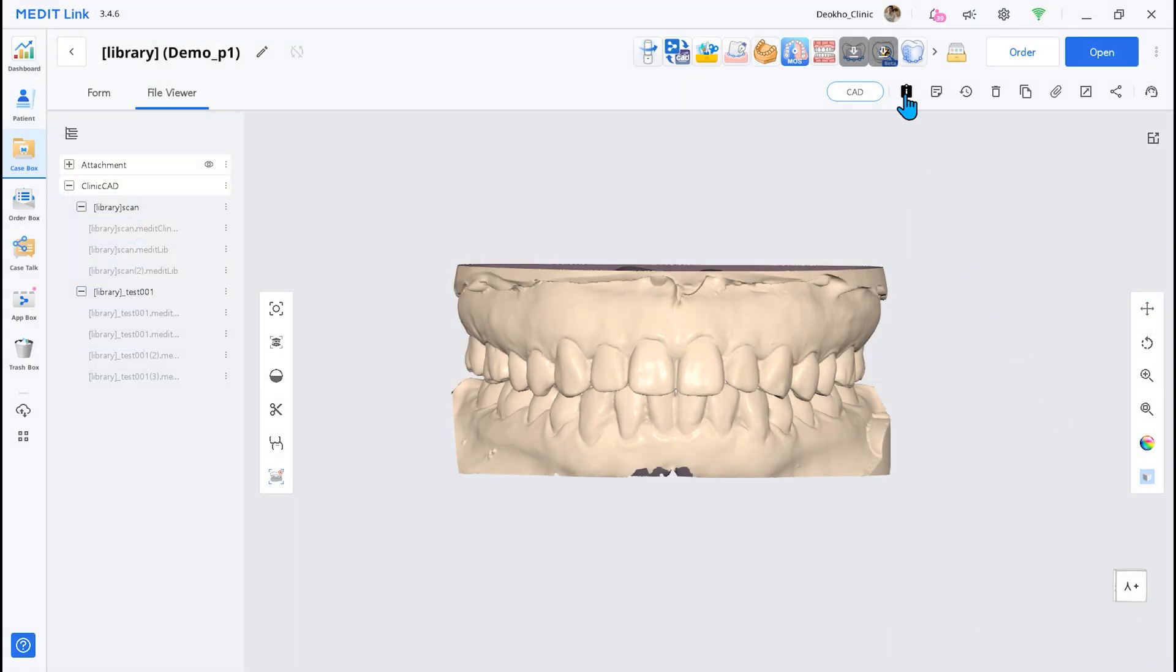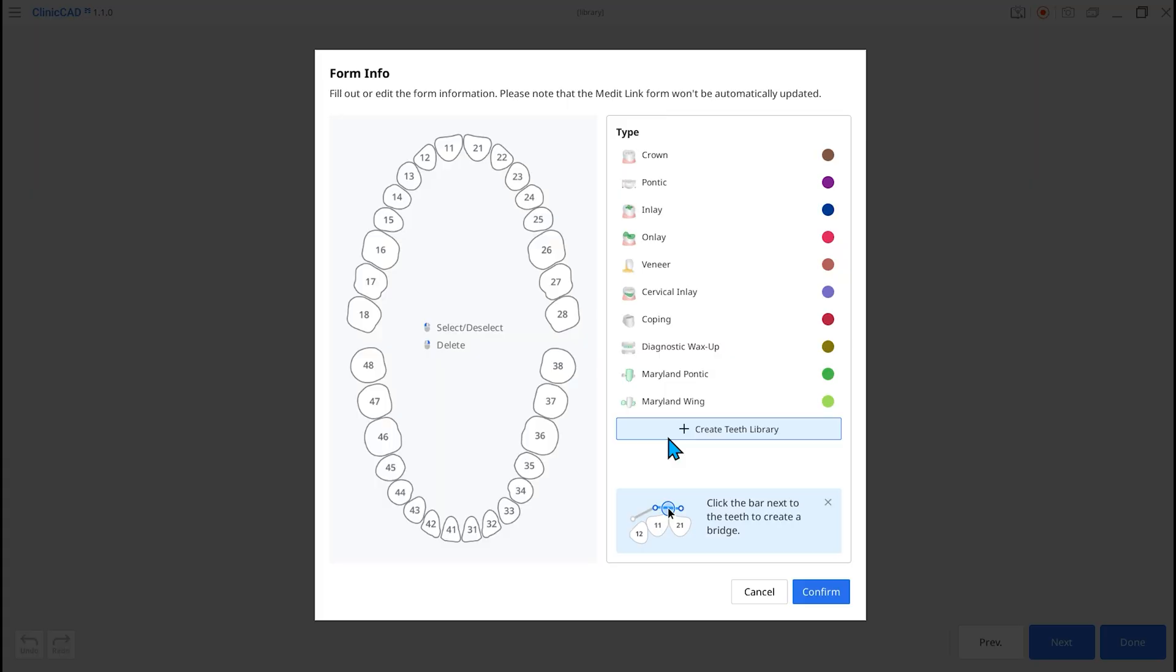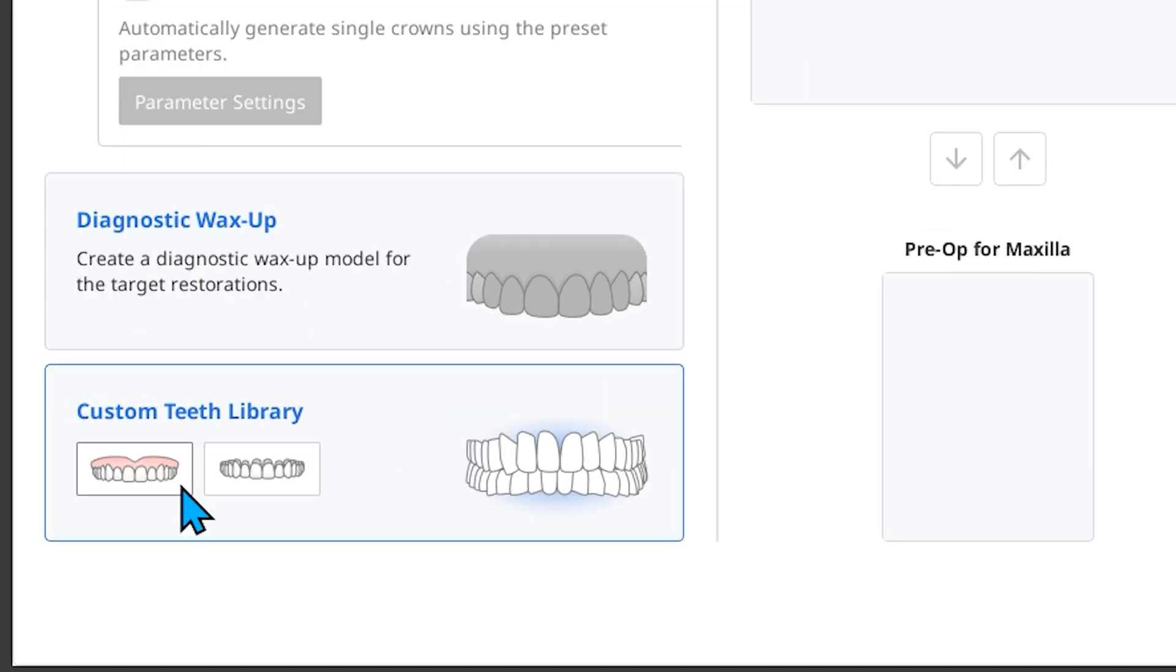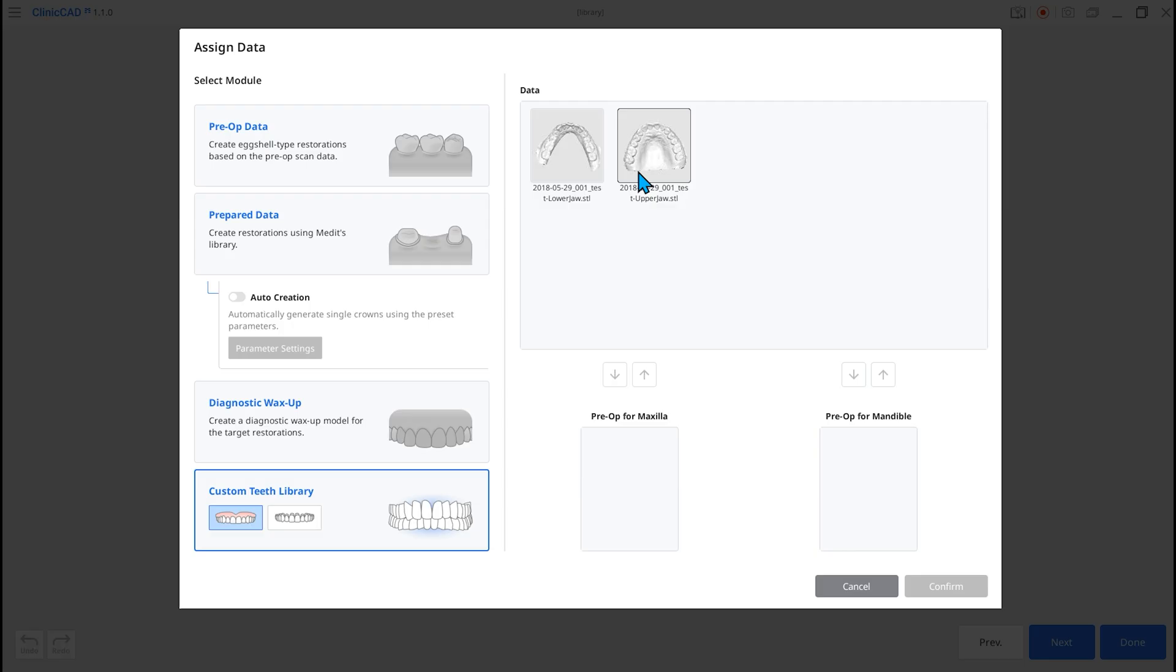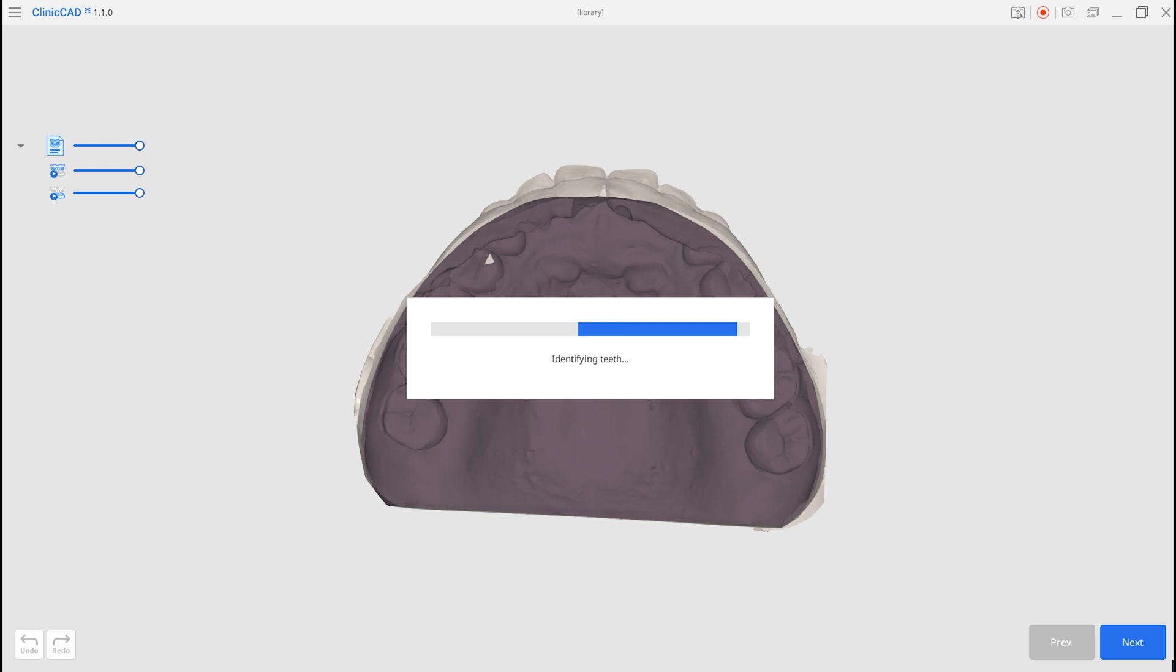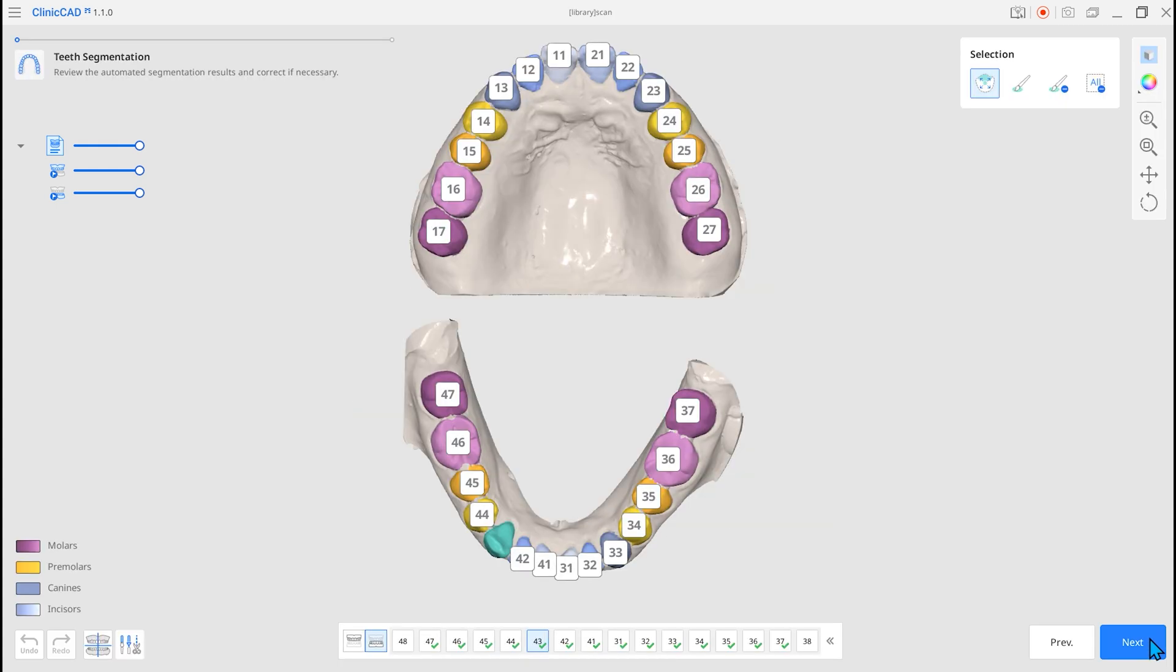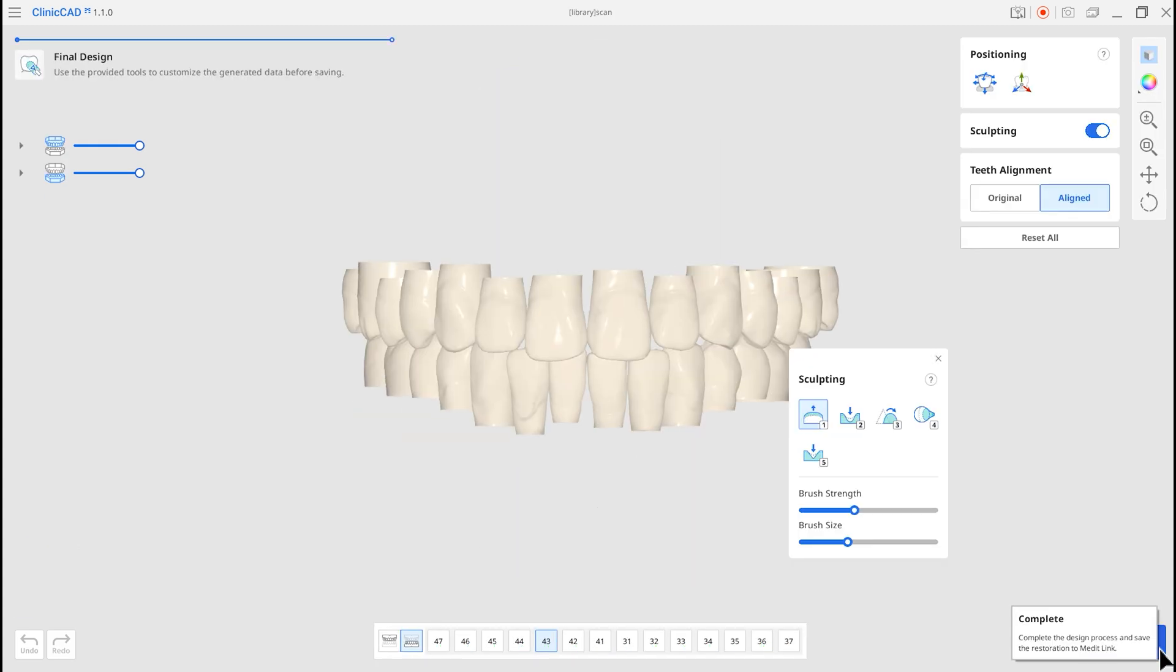Fifth, the Custom Teeth Library Creation Mode is added. In Custom Teeth Library, select from Scan Data. You can separate teeth from the arch data and create a library.